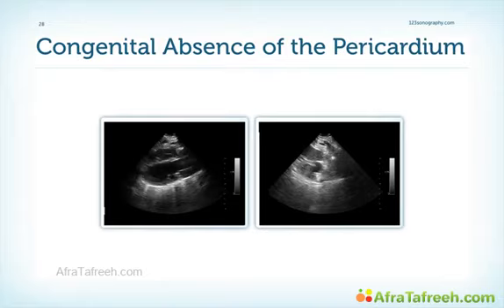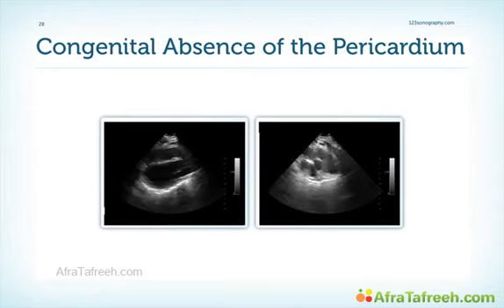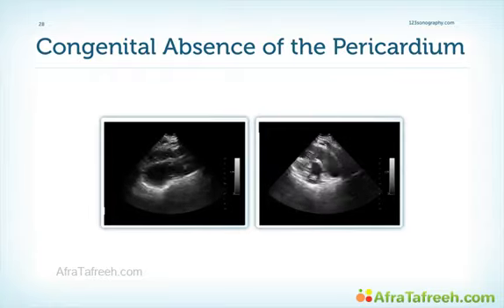It is not possible to directly visualize the absence of the pericardium itself. To suspect the diagnosis, you have to look at the configuration of the heart, the motion, and its position. To confirm the diagnosis, I would also recommend to use other imaging modalities.